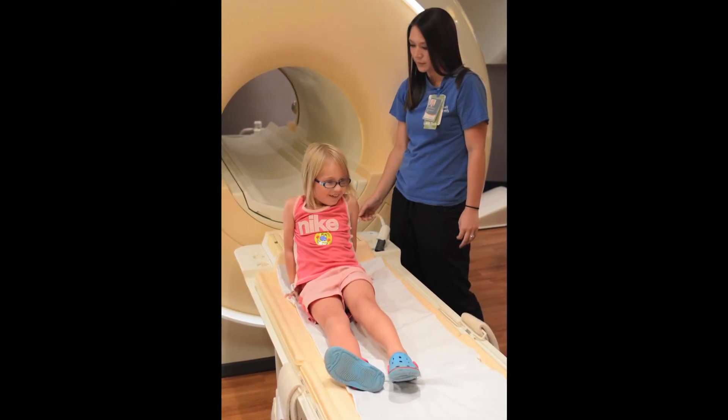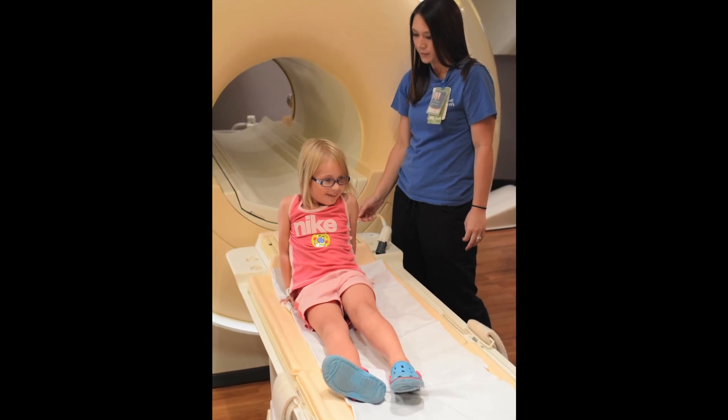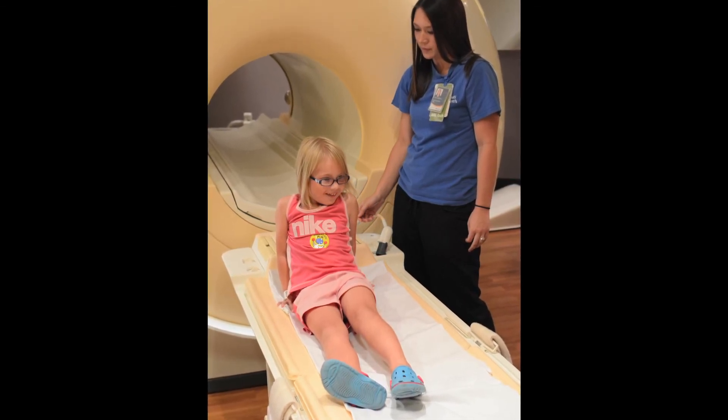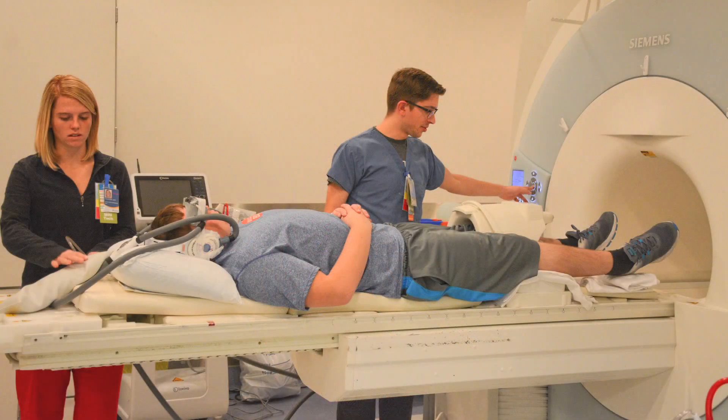Whatever coil is used, the technologist will do everything possible to make sure your child is comfortable and secure, so they are able to hold the joint still during the scan. If your child's knee is being imaged, they will lie on their back with the knee of concern padded comfortably in the knee coil.